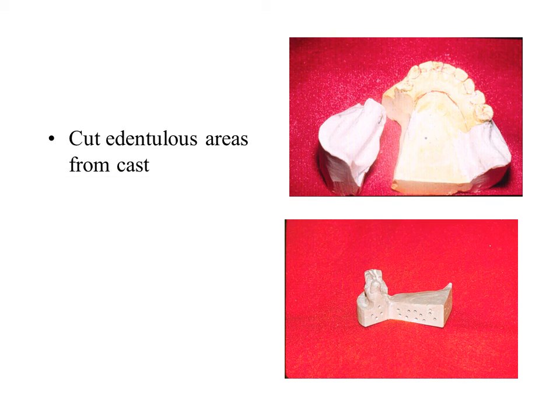Next, take the framework master cast, and cut the edentulous areas out of the cast, as seen in the figure. Secure the framework and impression to the cast with sticky wax. Make sure it is seated correctly. Box the impression. Pour the new cast. Remove the impression and base. Fabricate a new record base, test for rocking in the patient. Assuming this has been done correctly, you are ready to make a jaw relation record, and mount the master cast for setting teeth.